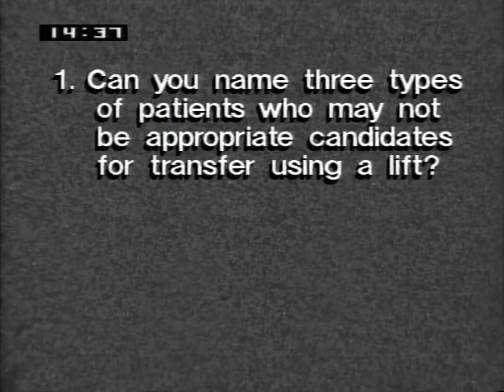After the transfer, document the procedure and any important observations. Be sure to contact your nursing supervisor if you have any concerns about the use of the Hoyer lifter in care delivery. It's time to check your knowledge.